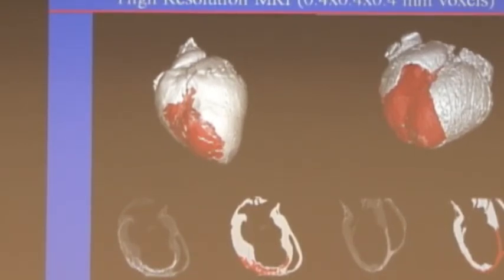You can have absolute intensity cutoffs. And it turns out that Tim Dickfeld, actually one of our former fellows, who is at Maryland now, has looked at this in detail about how you can define the gray zone most accurately. And it turns out all of the published ways, using standard deviations or using absolute intensities, give surprisingly different results. Yeah, because if you change your cutoffs, you can make one look exactly like the other. Exactly. Well, or very closely.